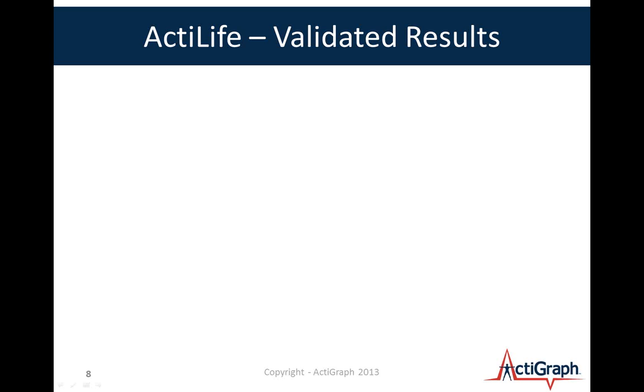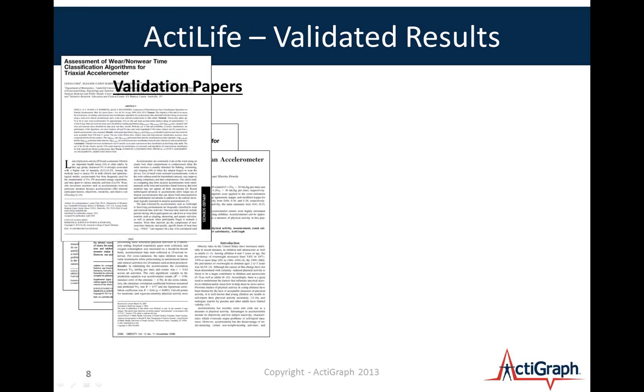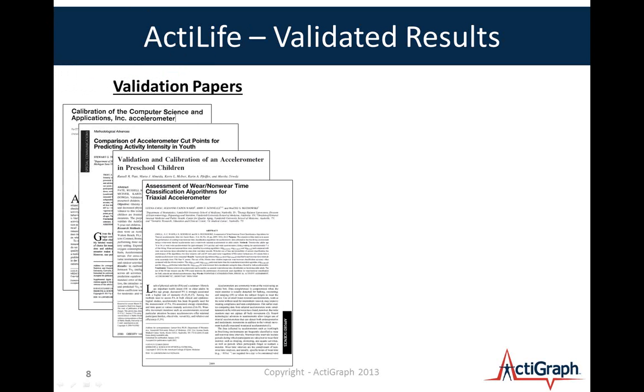A good segue into the Study Admin Portal is just a brief overview of the ActiLife tool. And many of you are familiar with that product. ActiLife provides validated results to our researchers, and I want to show you how it does that. So as we gather validation papers from our clients and research groups who have done research with our device, we gather those papers in, and everyone sees them. The researchers see them, clinical teams see them.